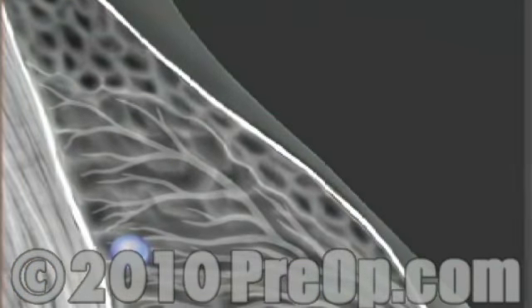There, the radiologist will inject a small amount of anesthetic in order to numb your breast. Then, using your last mammogram as a guide, the radiologist will insert a thin wire into your breast, moving the end of it towards the area of abnormality. This wire will serve as a pointer for the surgeon during your operation. The radiologist will perform another mammogram in order to verify that the wire has been placed correctly. It is possible that the wire will have to be moved or repositioned, and a mammogram taken once again.